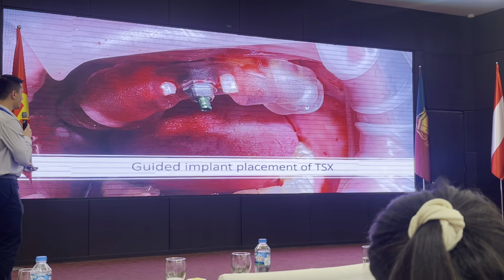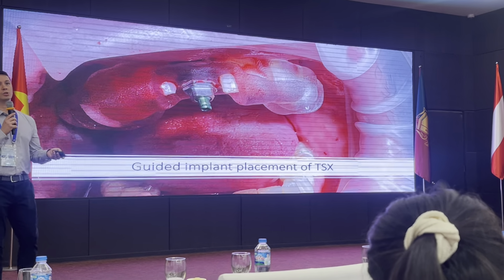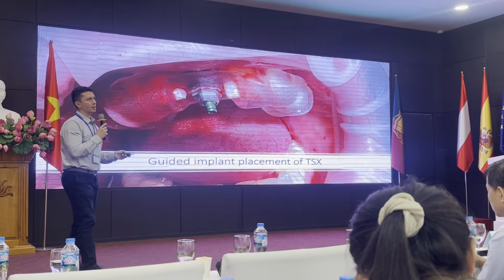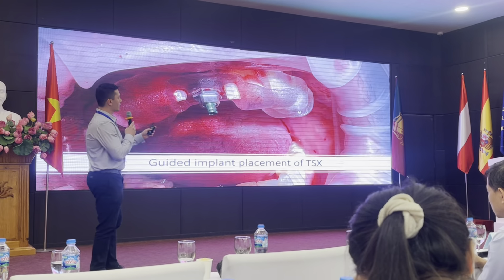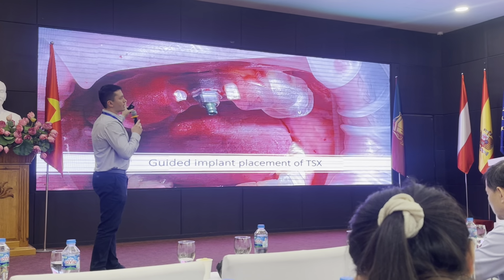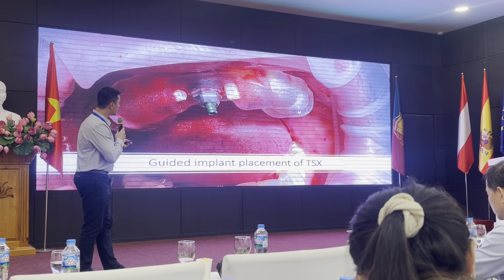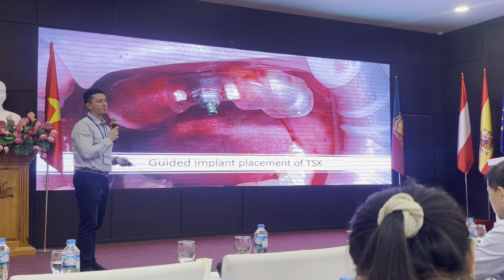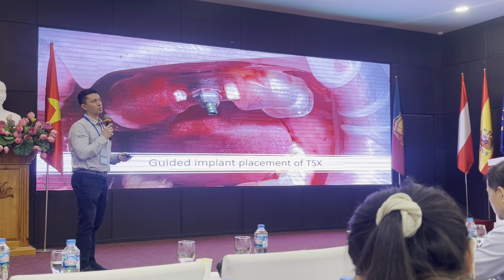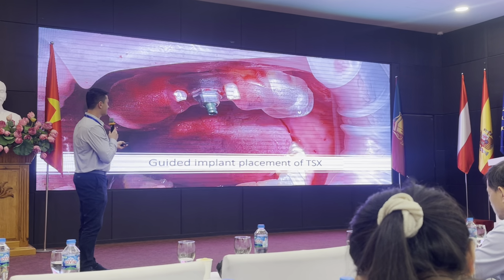And we place our implant. Again, this is a TSX implant. So we chose TSX. We could have also used a TSV implant, tapered screw vent implant. But like Doug was showing earlier, he showed a graph that had primary stability measured comparing a TSX versus a TSV implant. And we know that with an immediate implant, we have to make sure primary stability is achieved in order to have successful surgery. And so when we really need to make sure we have successful primary stability, we're going with TSX.